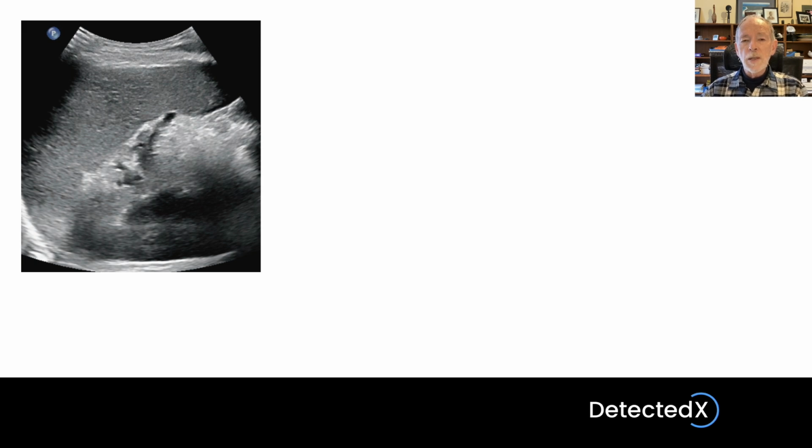So some minutes after ultrasound contrast agents have been injected, they begin to accumulate in the liver. This happens to be very useful because you can then produce images of the bubbles trapped in the liver, and you can look for any regions where this isn't happening, which are likely to be non-functioning liver tissue or some other kind of tissue entirely.